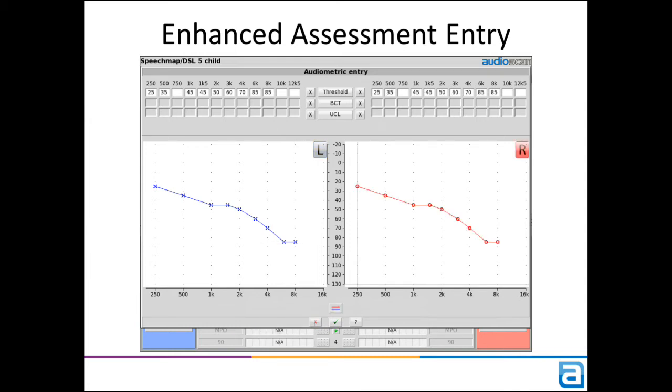Further data types can be entered in the same window. For example, if you had bone conduction thresholds, you would select the BCT button. These can then be entered on the same graph.